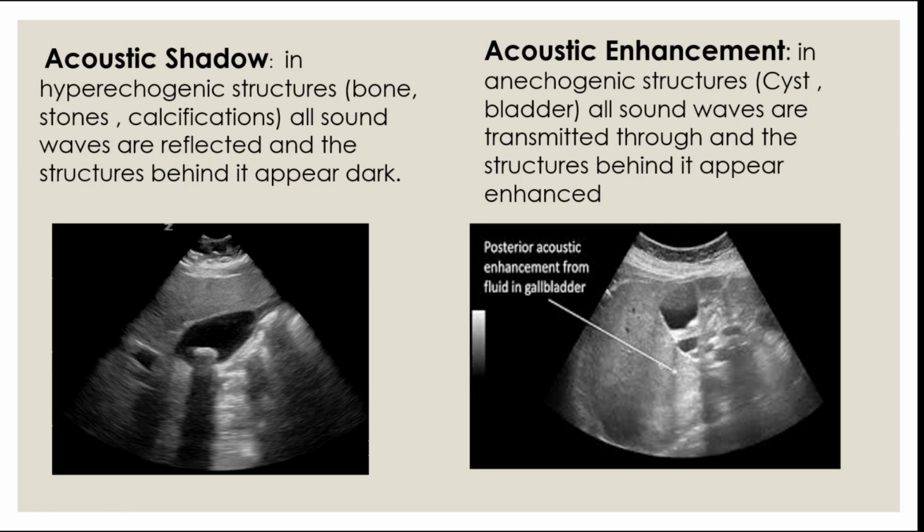If it is acoustic enhancement, it's usually anechogenic structures. So we talked about them, like cyst, vessels, the bladder, any fluid filled structures. All the sound waves are usually transmitted through, and the structures behind it usually absorb the sound energy and disperse it, making it appear enhanced. So acoustic enhancement. Sometimes they call it posterior acoustic shadow and posterior acoustic enhancement, but you can just know them as acoustic enhancement and acoustic shadow.